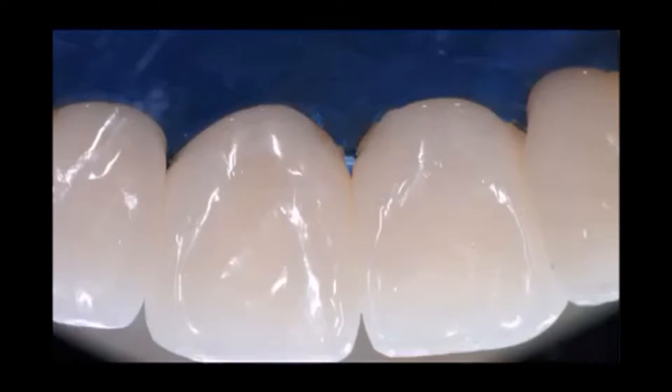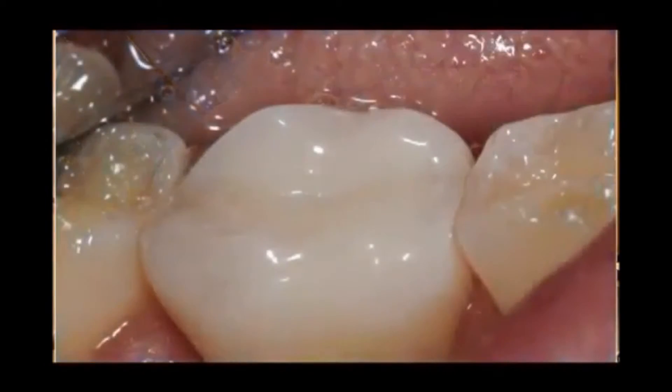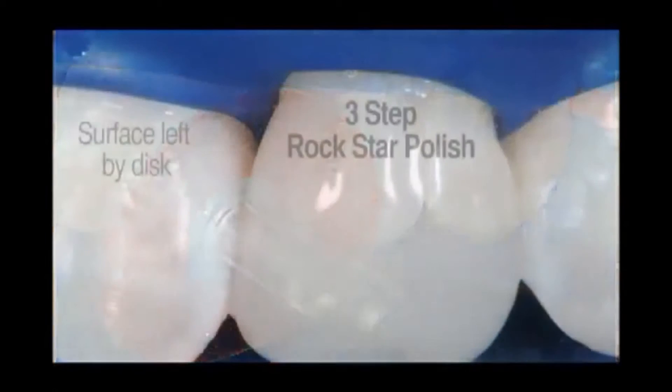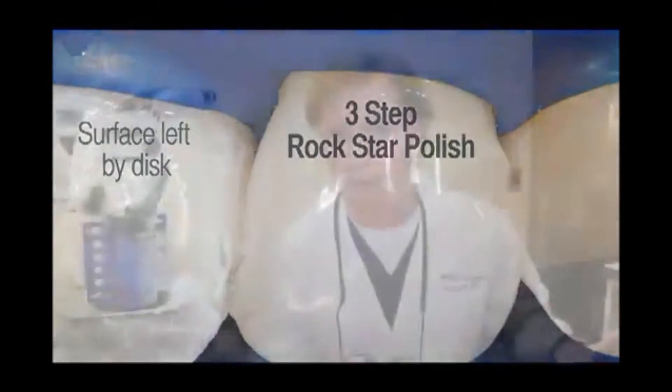It should take between 30 seconds and 3 minutes, depending on the tooth, to do this beautiful finish. And it's a little counter-intuitive — it's not what you're going to expect. One of the problems with traditional composite finishing is that it's not smooth and it's too flat. When we use discs or some of these systems they sell you to polish the composite, they don't work very well and they're overpriced. We won't talk about gross finishing today.